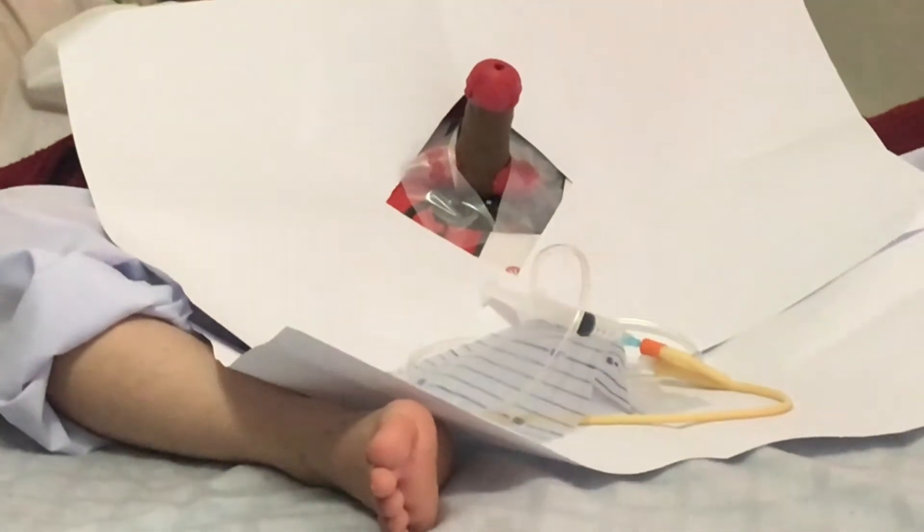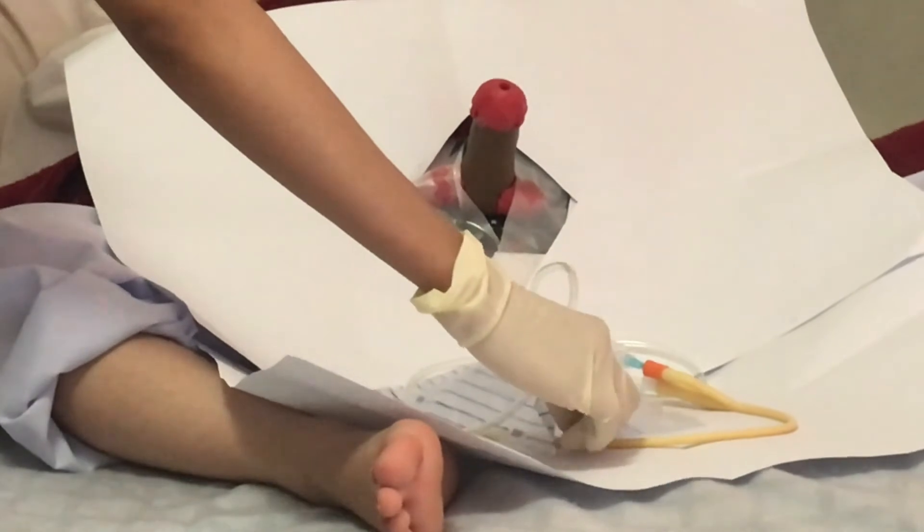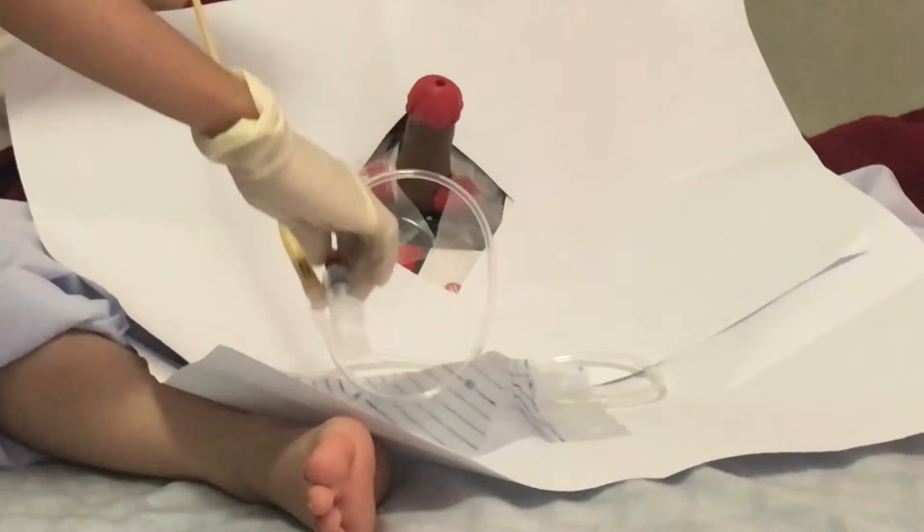Next, lift the penis with the non-dominant hand perpendicular to the patient's body. Pull up slightly and straighten, and gently press both sides to help open the meatus.